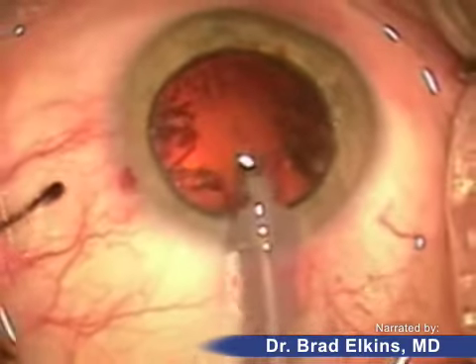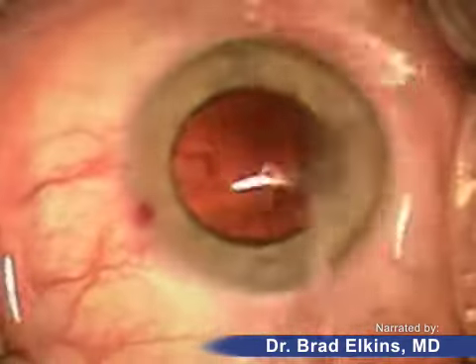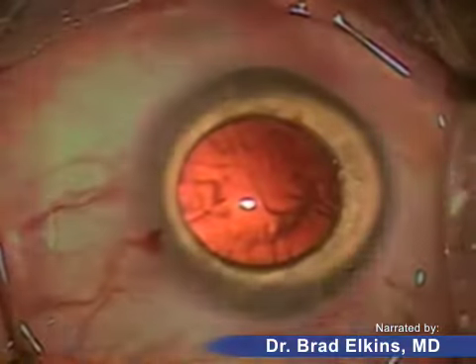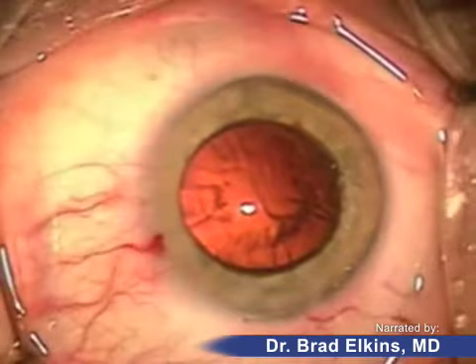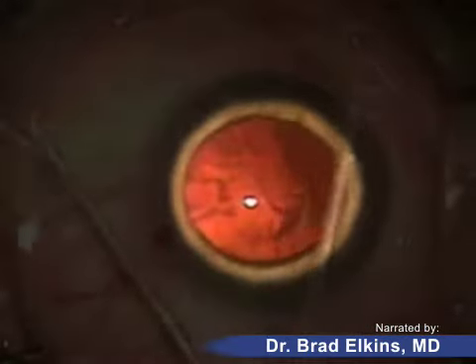Miraculously, these patients are not feeling any of these manipulations or maneuvers. You can probably notice how much brighter the red reflex — the reflected light — is with the cataract having been removed. These wisp-like structures are called cortical fibers, which are going to be removed now with a separate instrument that aspirates the fibers off the lens capsule.